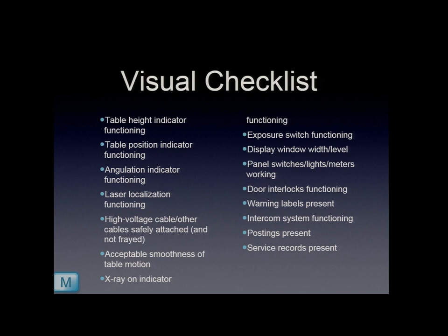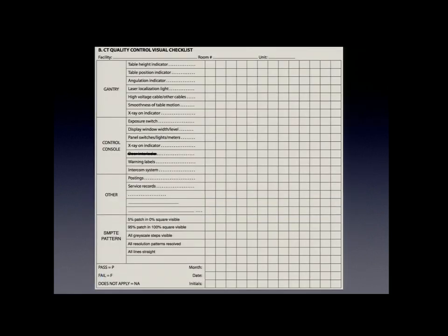And then service, if they're coming in, this is really probably one of my biggest pet peeves. I come and say, can I look at the service records? And they say, Joe's going to send them to me. He was here 3 months ago. I say, can you please have him send them to me? I want to see where things are. They really should be present. That's really required to be there, especially when there's corrective action. How else can you document that corrective action was actually performed unless you have a report that it was done?